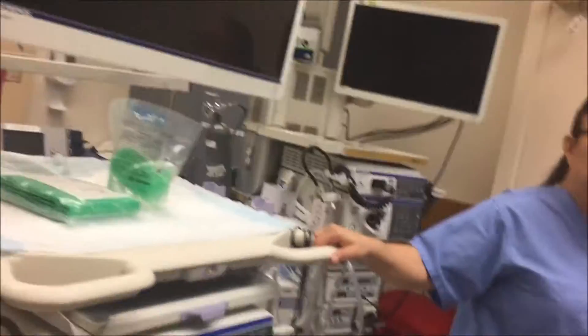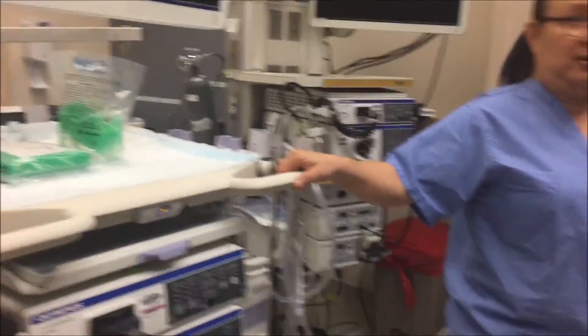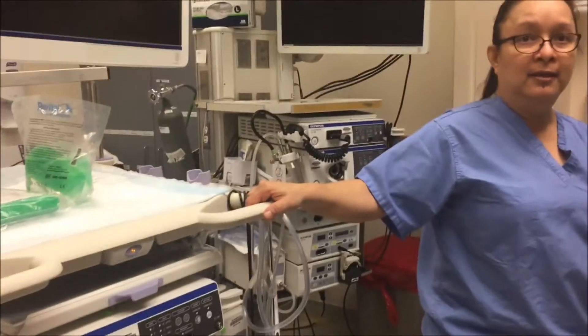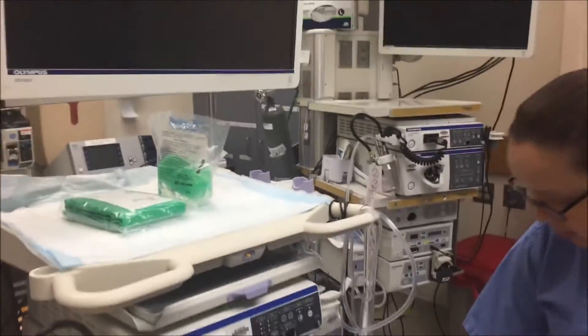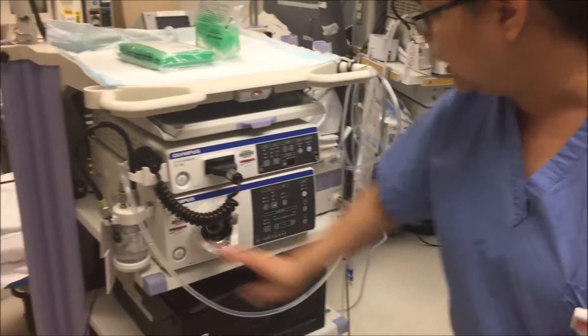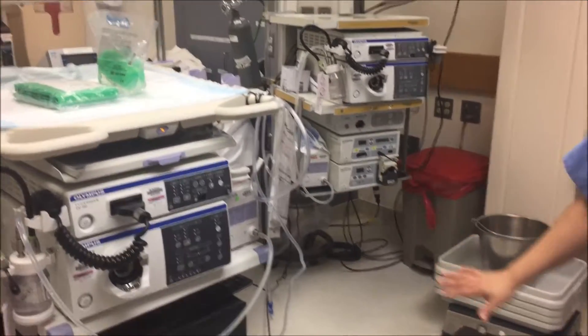The first step in setting up the cart is to grab the cart and all the equipment from room 2 in the endoscopy unit. This is how you're going to find the water set up for you and the irrigation tool — this is exactly how the cart is going to be.